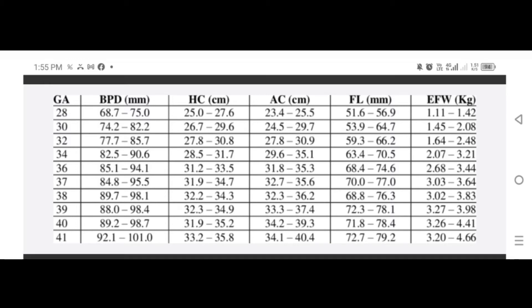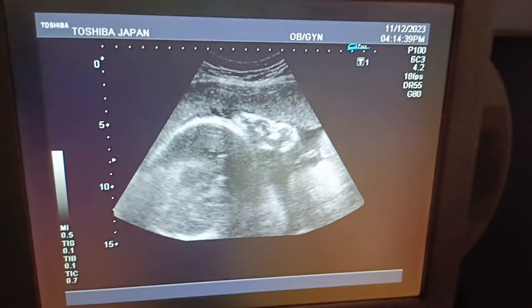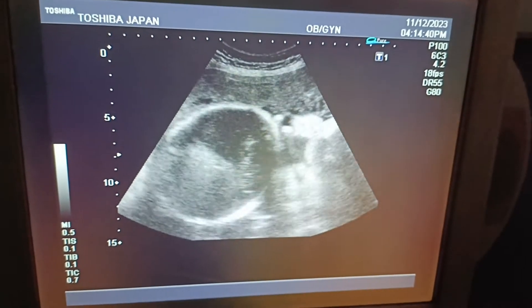This is the fetal parameters chart. You can see the fetal parameter measurements at 35 weeks of pregnancy — the BPD, HC, FL, etc. Now coming to the live case: this is a pelvic scan of a 30-year-old female at 35 weeks of pregnancy.